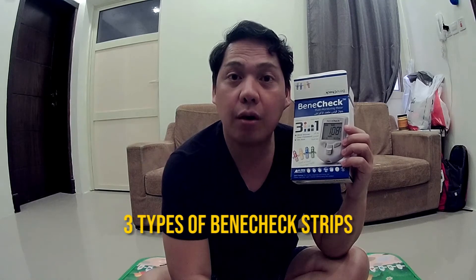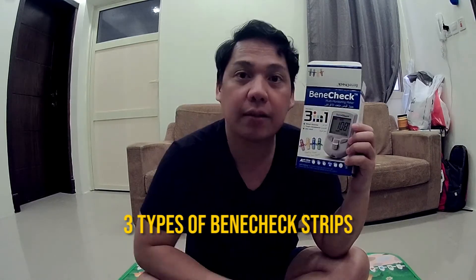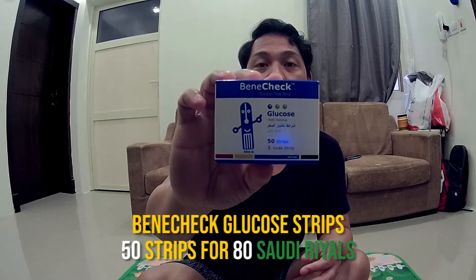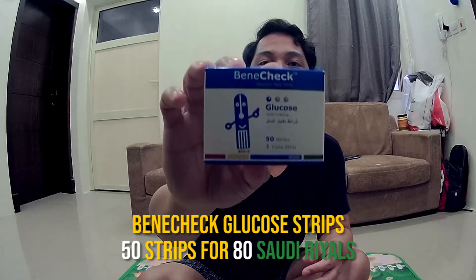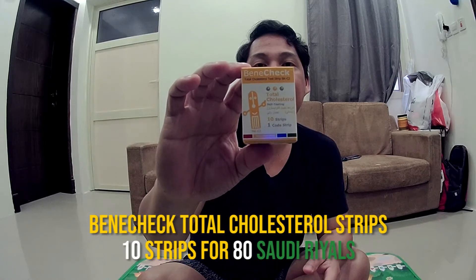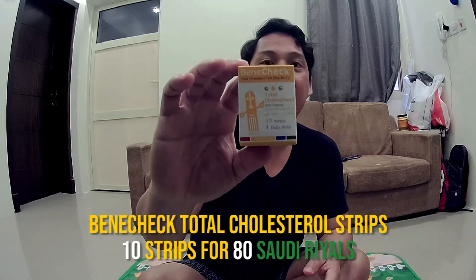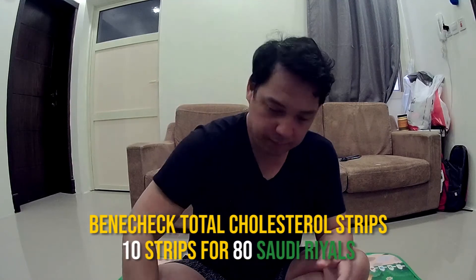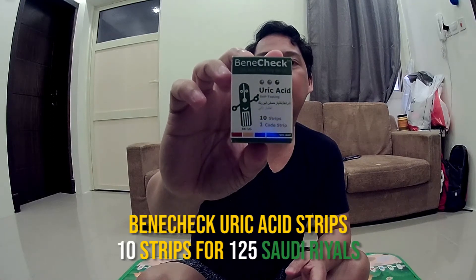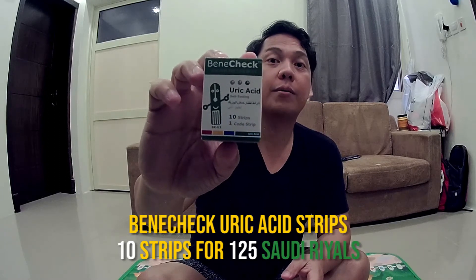The first strip is called the Benecheck glucose strip, and I got this for 80 riyals — it has 50 strips. The next one is the total cholesterol strip; it has 10 strips and I got it for 80 riyals. And the last one is called the uric acid strip — it has 10 strips and I got it for 125 riyals.